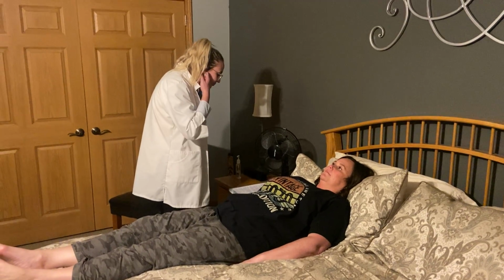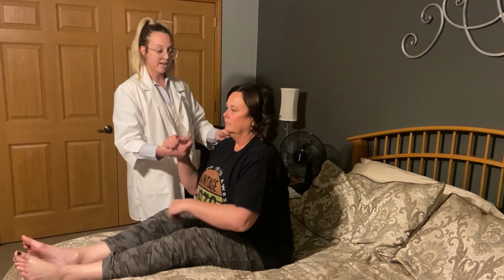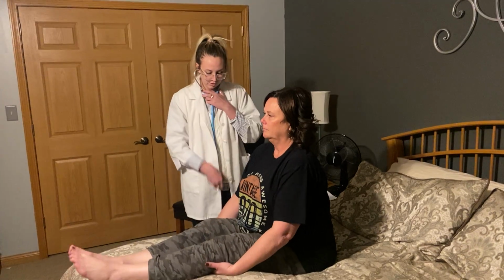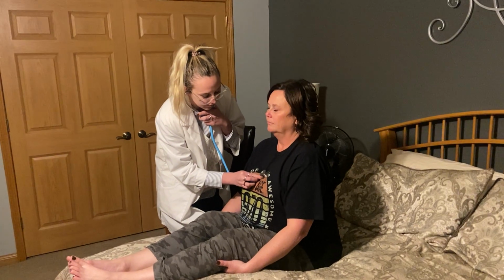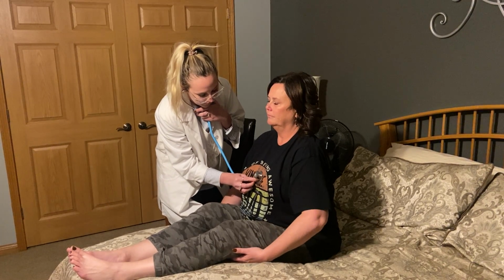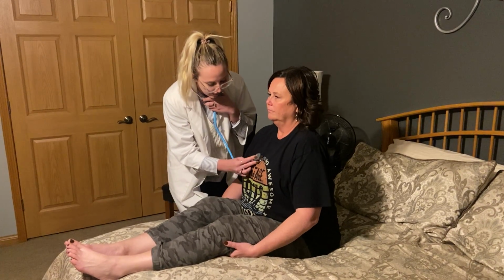Okay, very good. Now next, Rhonda, I'm going to have you sit up just at a normal height here so I can help you sit up a little bit if you need. And I'm going to do the same thing. I'm going to listen with the diaphragm and the bell of my stethoscope in all of the spaces again. Okay, going to flip to the other side of my stethoscope.